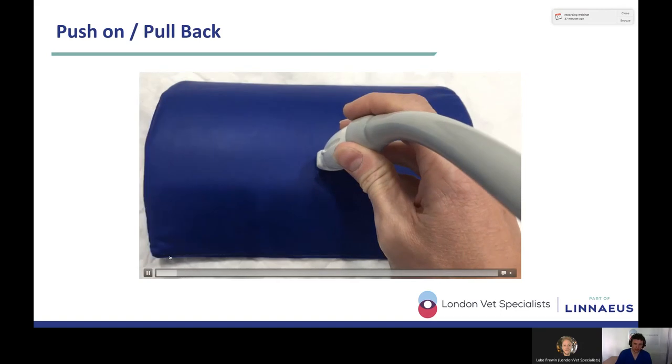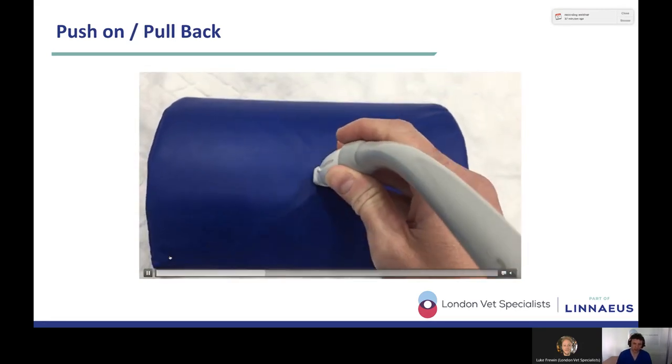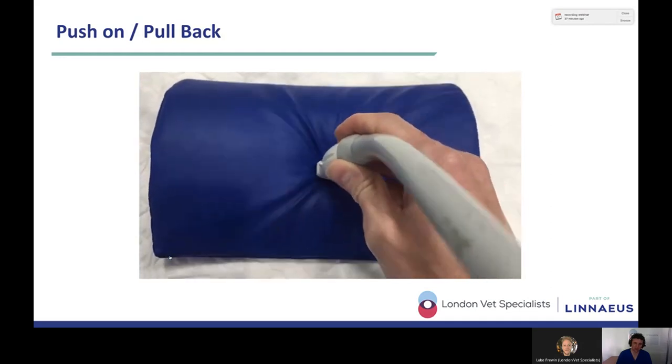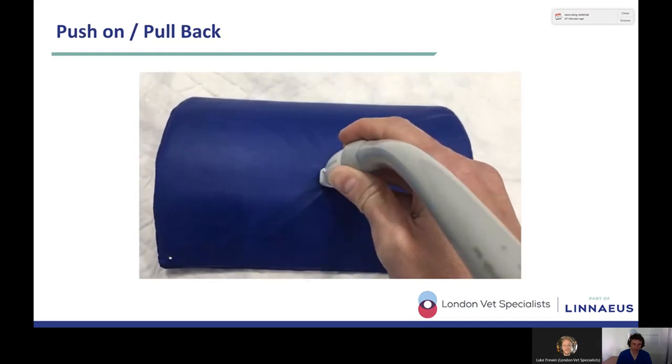Now here, I am holding the probe a little bit more like a pen than I am a torch. And that's really for demonstrational purposes, because it's much easier for you guys to see what's going on if the probe is on the top of this little foam pan than up underneath.